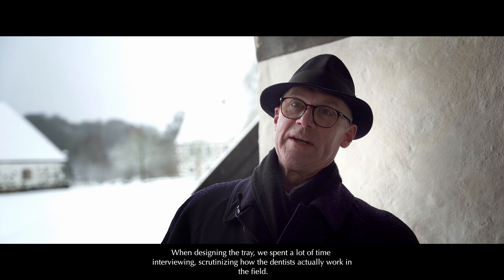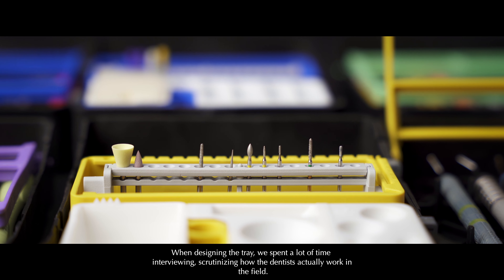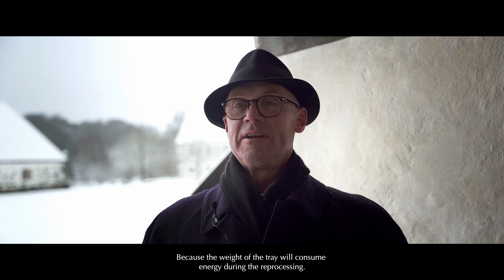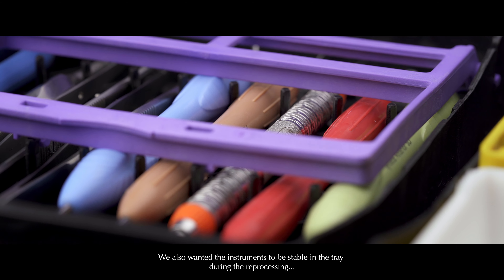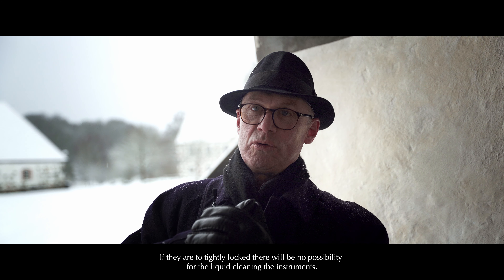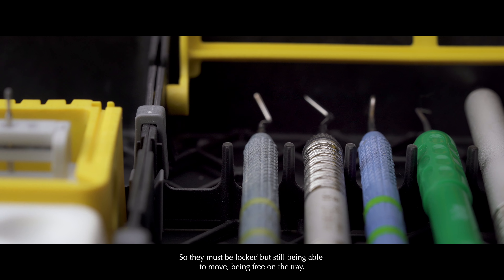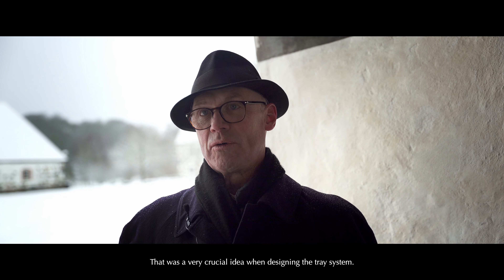When constructing the tray, we spent a lot of time interviewing and scrutinizing how dentists actually worked in the field. What we could see was a need for a light tray, because the weight of the tray will also consume energy during reprocessing. We also wanted the instruments to be stable in the tray during reprocessing, but they couldn't be locked in the tray. If they are too tightly locked, there will be no possibility for the liquid to clean the instruments. So they must be held, but still being able to move — being free on the tray. That was a very crucial idea when constructing the tray system.